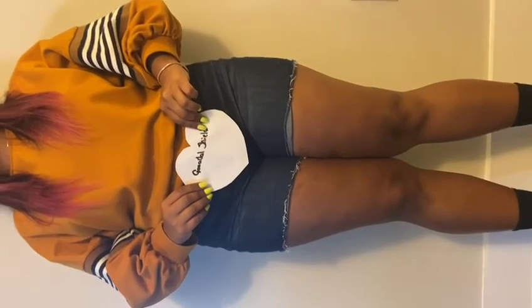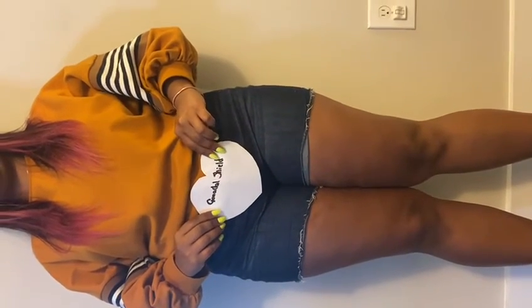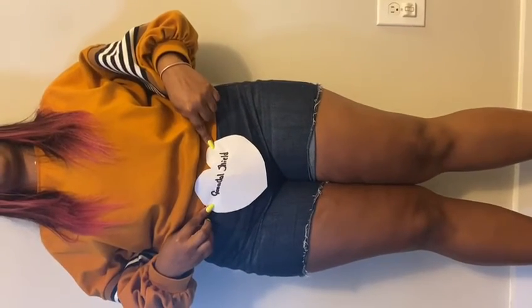We're gonna use a gonadal shield, and the center ray for females is gonna be 30 to 45 degrees cephalic, entering at the pubic symphysis or greater trochanter, and for males 20 to 30 degrees cephalic.